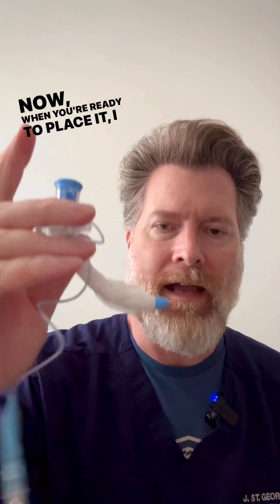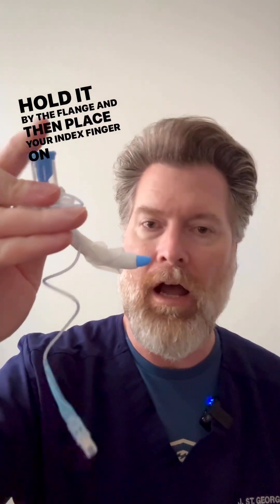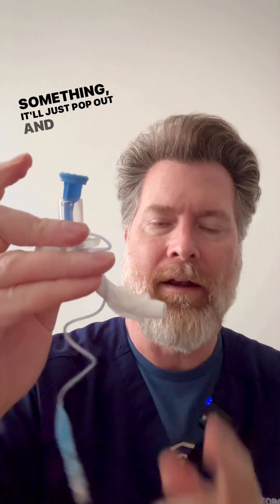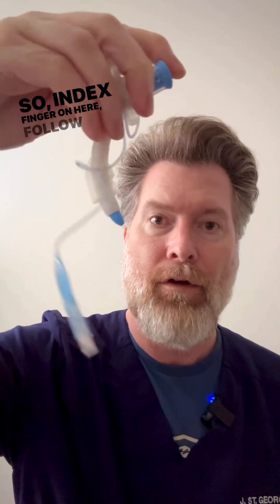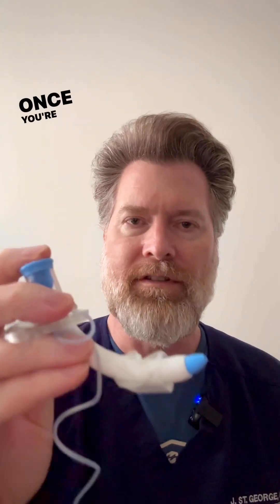Now, when you're ready to place it, what I like to do is hold it by the flange and then place your index finger on top of the obturator. Because if you don't and you sort of hit something, it'll just pop out — and that defeats the purpose, and this sharp edge will then become exposed again. So index finger on here, and follow the curve of the stoma into the trachea.